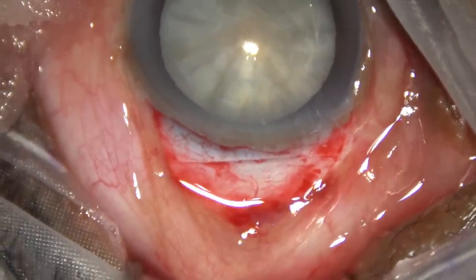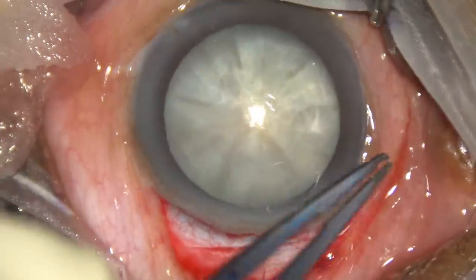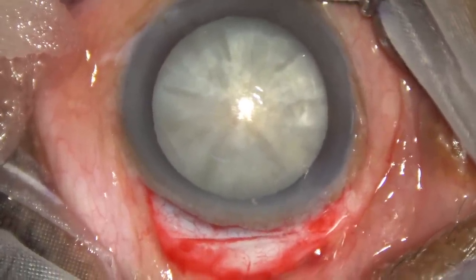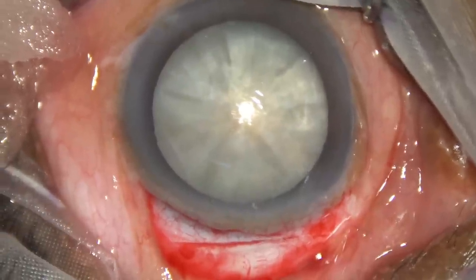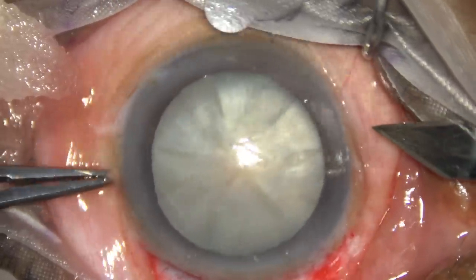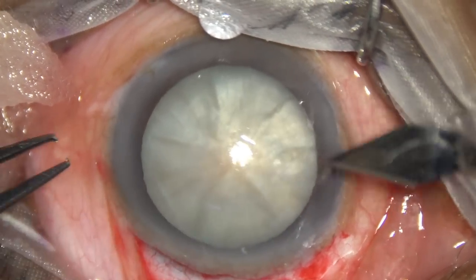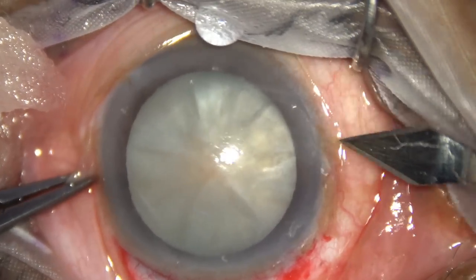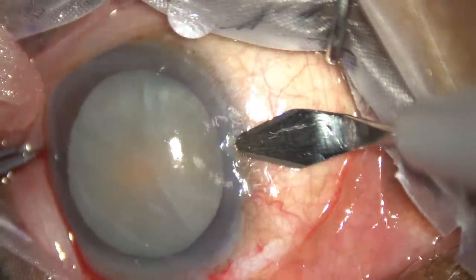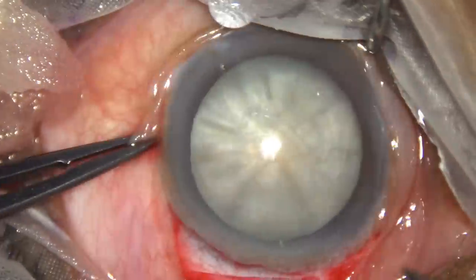Now we release the superior rectus bridle suture. This is the left eye of the patient, and I am finding it difficult to make the side port with the lancet knife. So I am using the keratome. We will introduce half of the keratome and we will get an adequate sized side port. This should be okay.